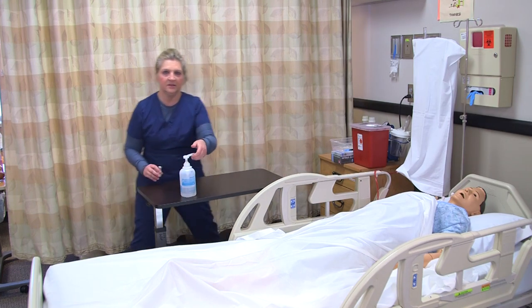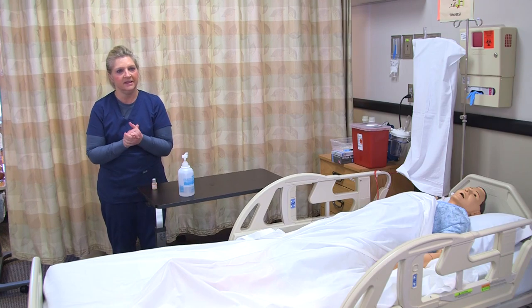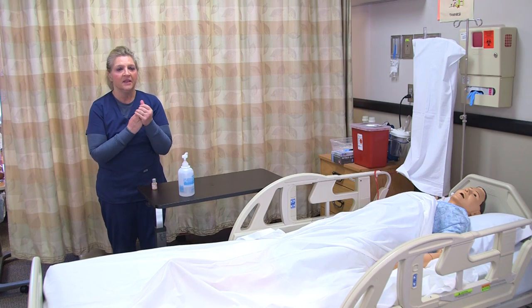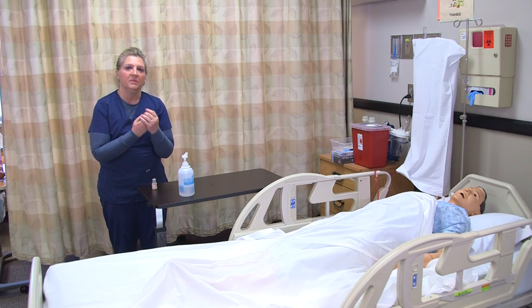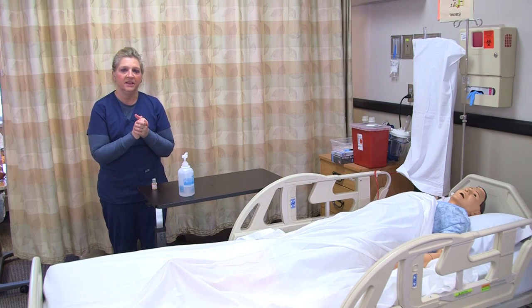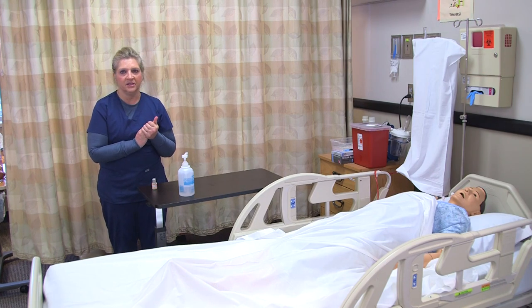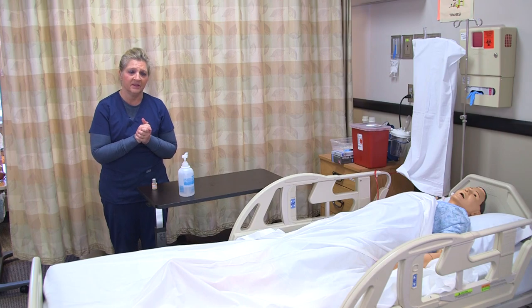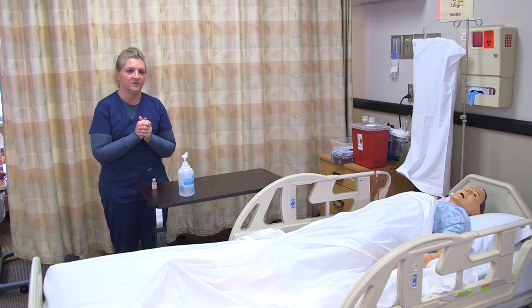I'll wash my hands and exit the room, making sure that I document what I have done — the medication that I gave and how the patient tolerated it. You also want to document the IV assessment that you performed as well.